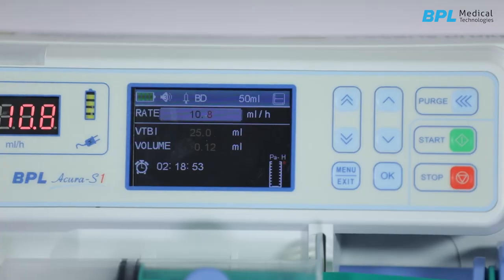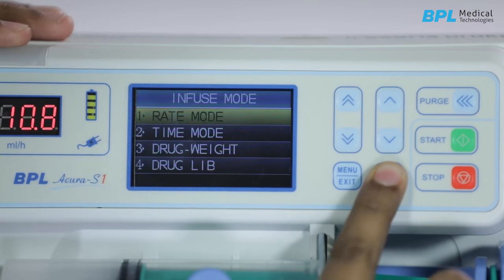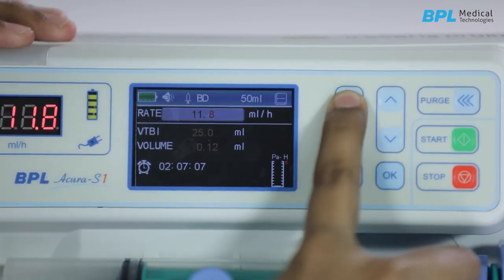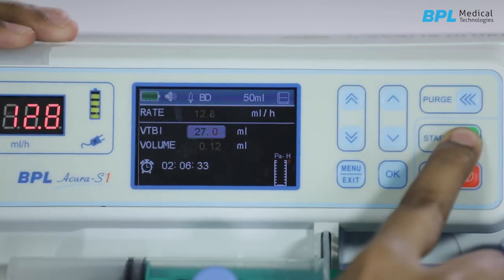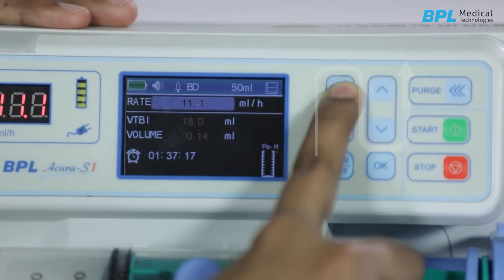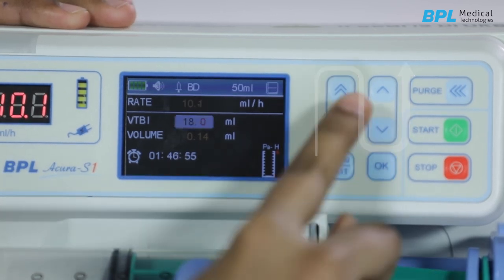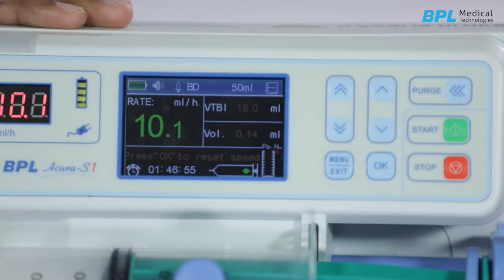The default injection mode of this pump is flow rate mode. You can choose other injection modes in this menu. To use flow rate mode, press OK to select and confirm the parameters. The cursor will move circularly among the parameters; the incremental and decremental keys are used to adjust the parameters. After all parameters are confirmed, press the start button to start infusion.